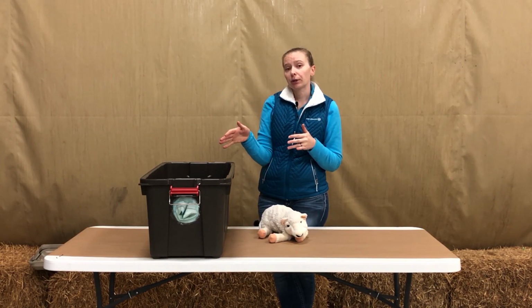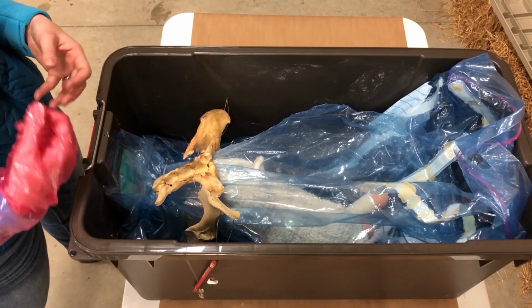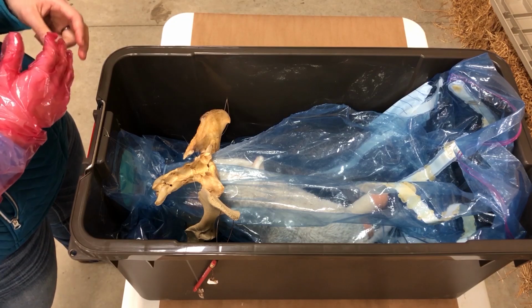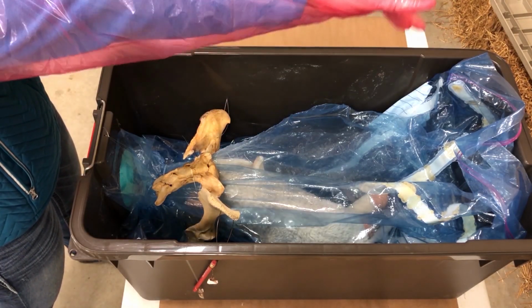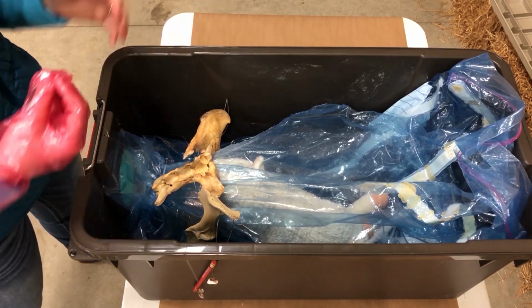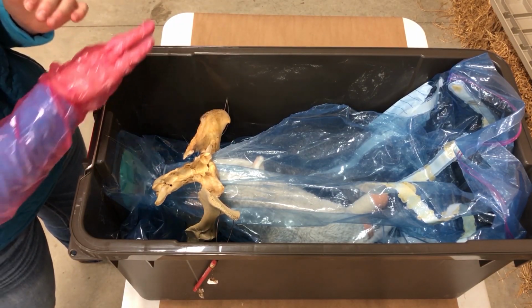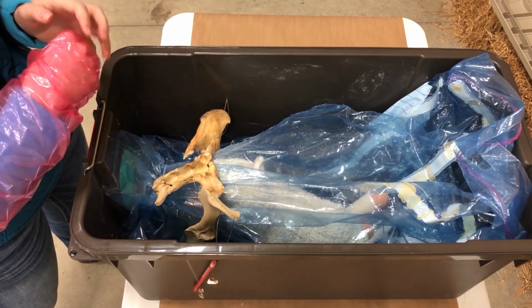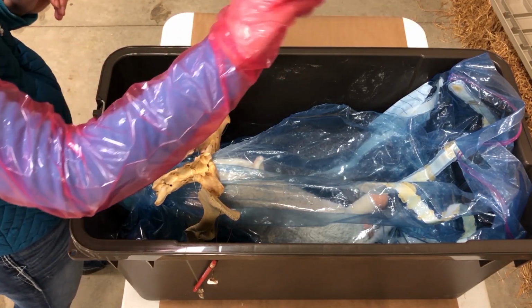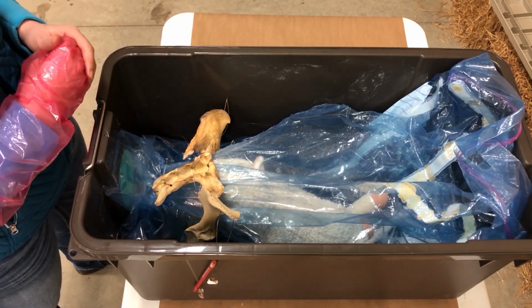So we're going to show you a little bit about a ring womb situation in our simulators. Remember that we definitely want to be using sleeves as much as possible, OB sleeves or breeder sleeves we can use, and lubricant. Use as much lubricant as possible to get up in there and try to work that around, especially when you're in the scenarios where you're having to push back in, or when you're in that ring womb scenario where you're trying to open that cervix up.